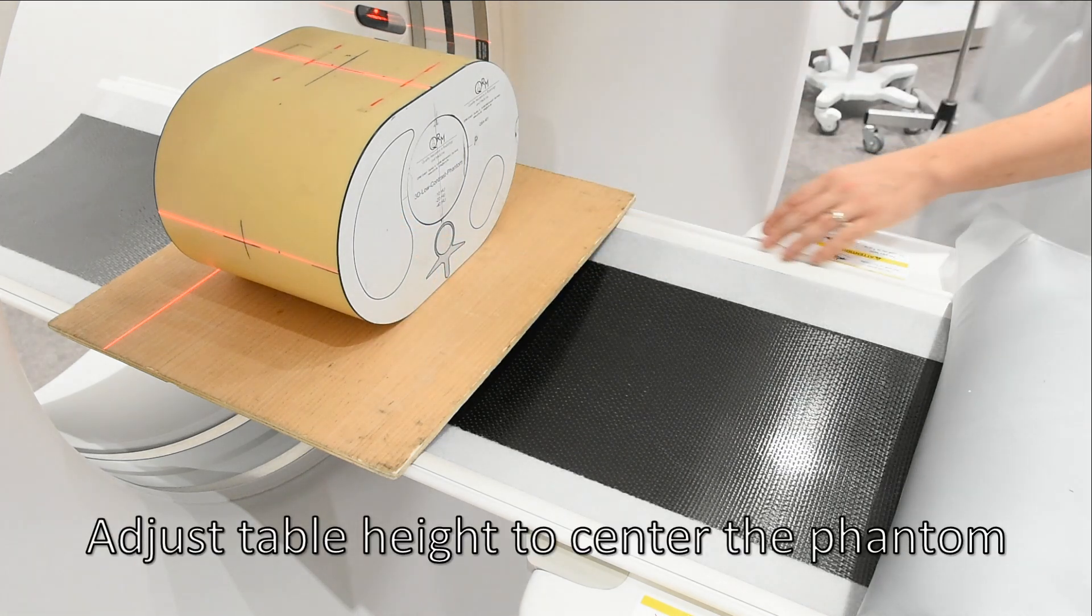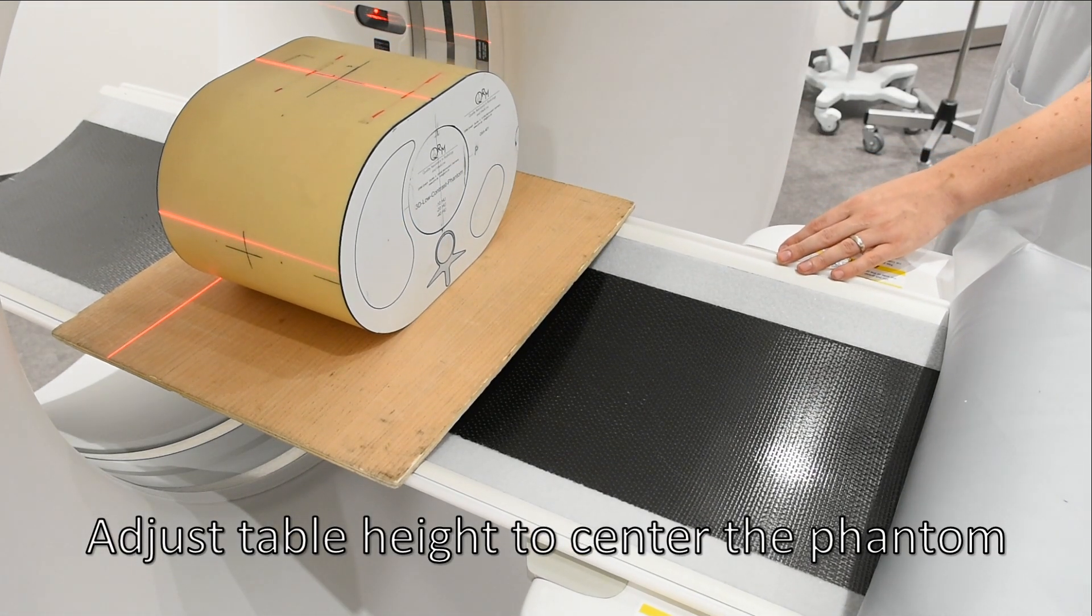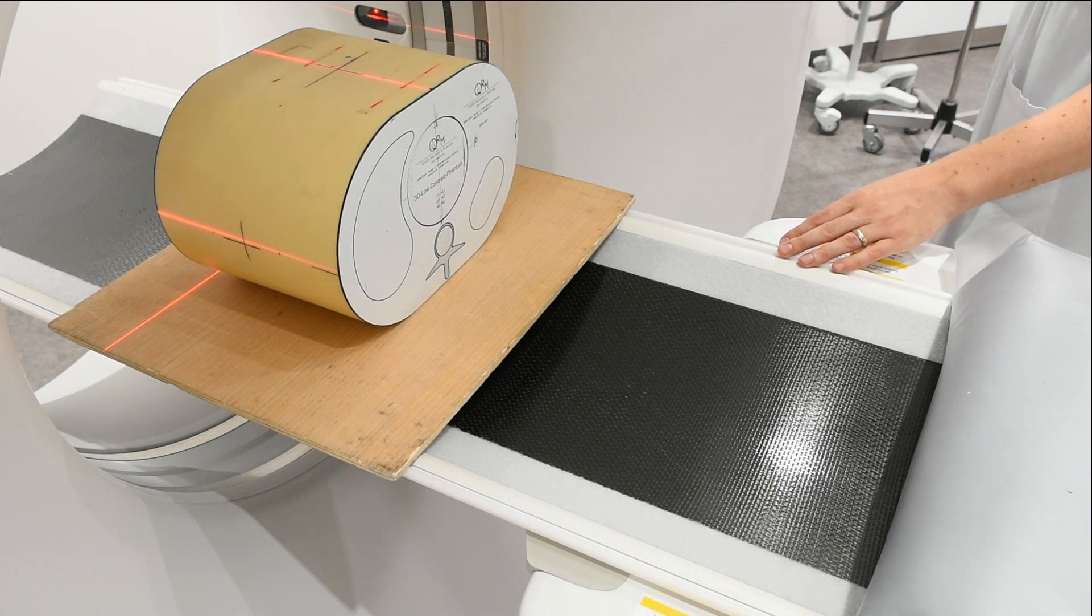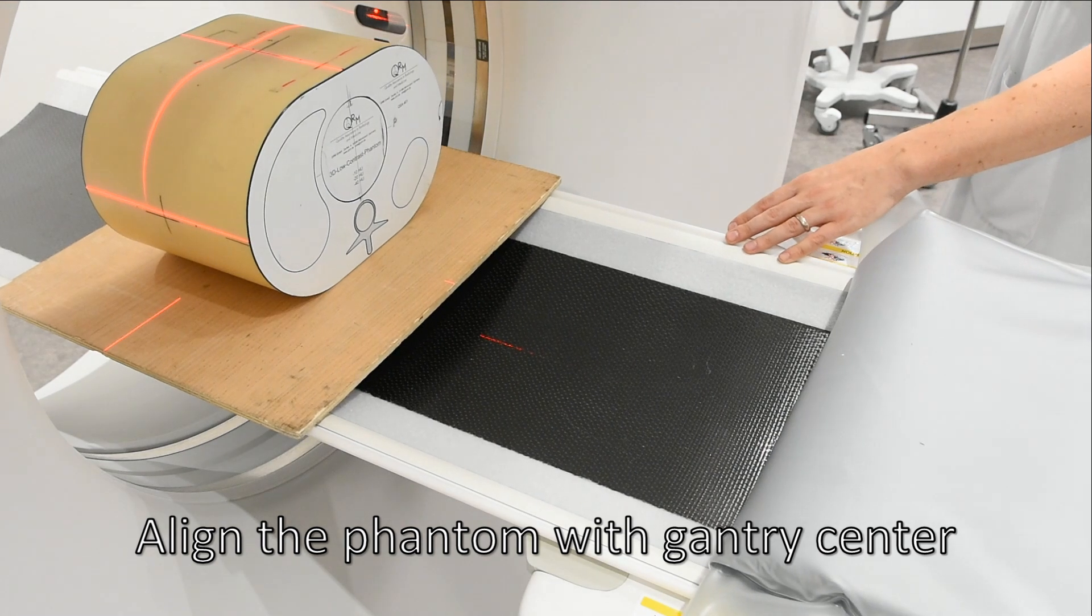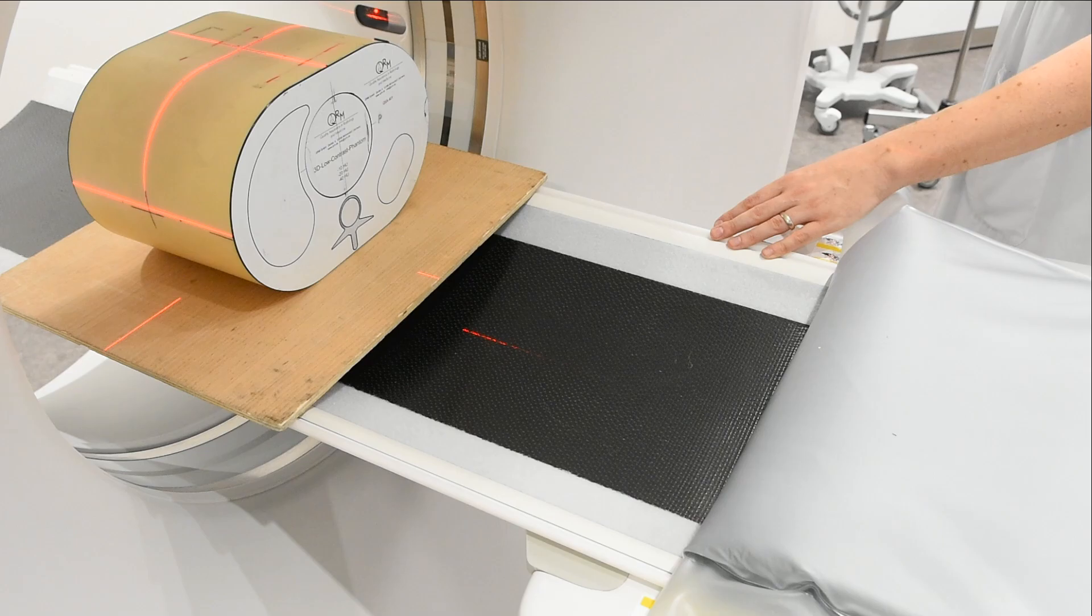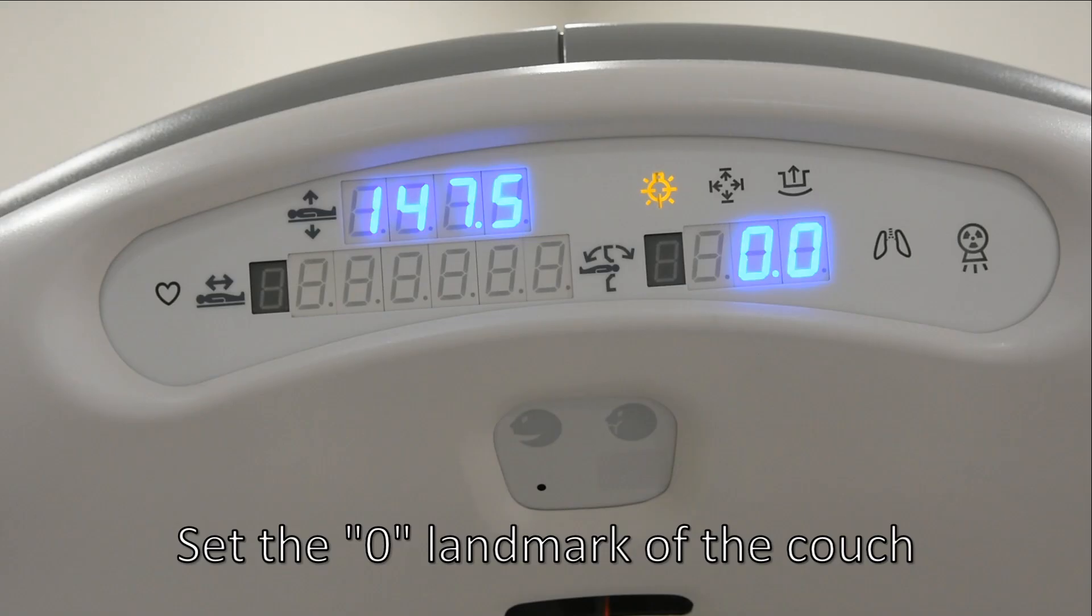Adjust table height to center the phantom. Align the phantom with gantry center. Set the zero landmark of the couch.